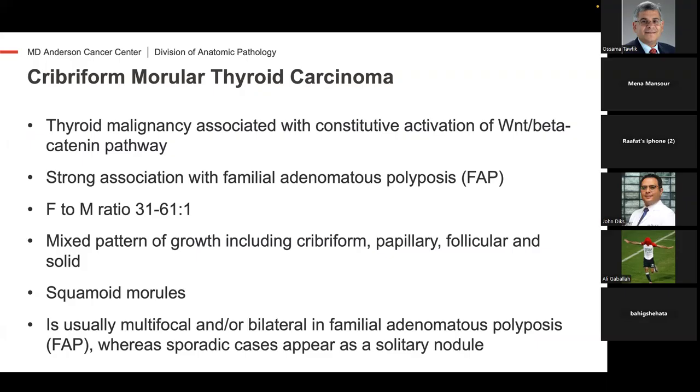I'm not sure. I think it's just actually TTF1. Okay. In patients with FAP, they're usually multifocal or bilateral. In sporadic cases, it's usually a solitary nodule. They behave pretty indolently. They're not very aggressive, but they're pretty rare. So it's nice when you see one of those tumors.